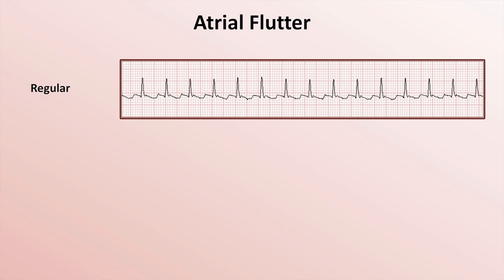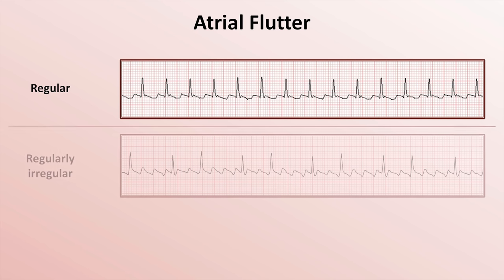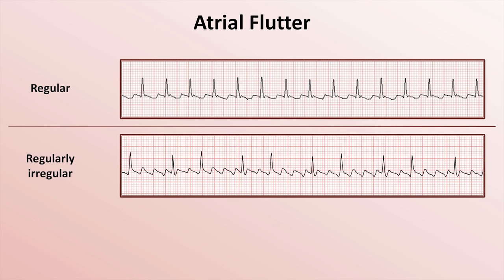Let me show you three variations of atrial flutter. First is a regular ventricular response, in this case a consequence of 2-to-1 AV block, producing a ventricular rate of 150. Occasionally, AV block can manifest a pattern in which 4-to-1 AV block alternates with 2-to-1 AV block in a repetitive pattern, resulting in a regularly irregular ventricular response. If the atrial rate is around 300, this pattern results in a ventricular rate of around 100. The second QRS in each pair often comes slightly late, which is fairly common in this pattern.